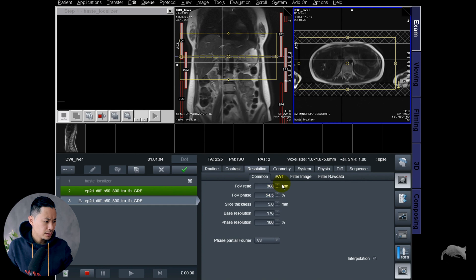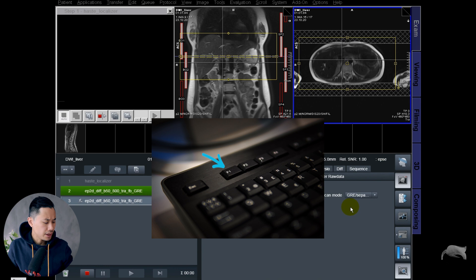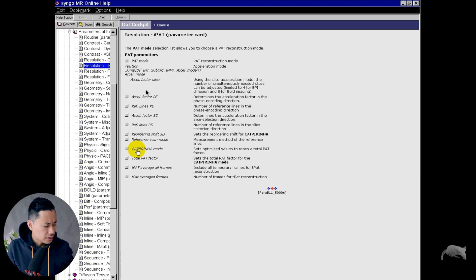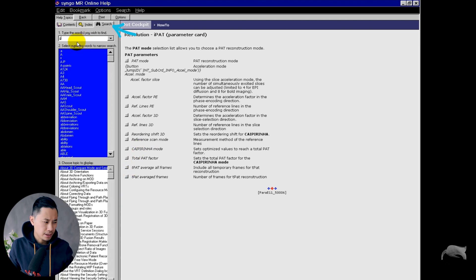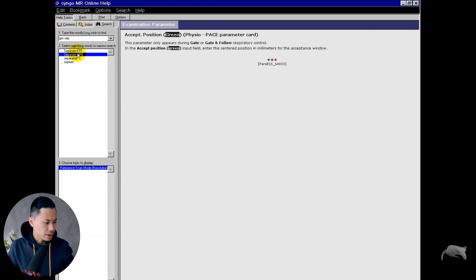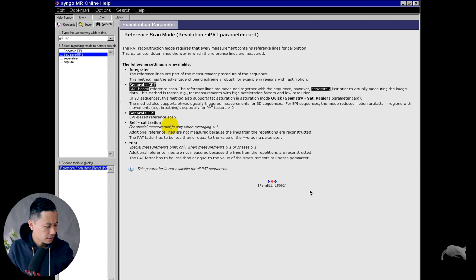Before we continue, let's see what the differences are between the gradient and the EPI. You can push the F1 button right here — whenever you push F1, you go to the help mode. You could also do a search mode right up in the corner here. We're going to search for 'gradient' and 'separate.' There you go — in here you have two options: gradient separate and EPI separate, so you can do further reading for a better understanding.